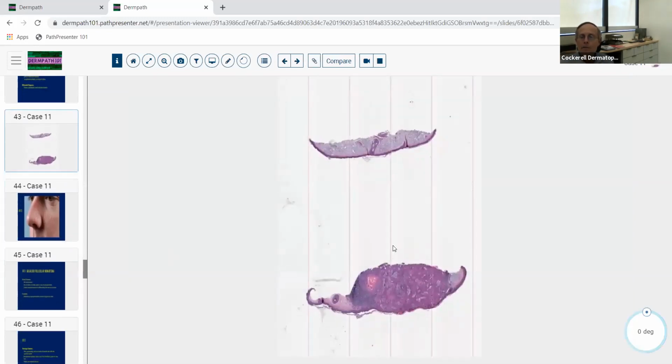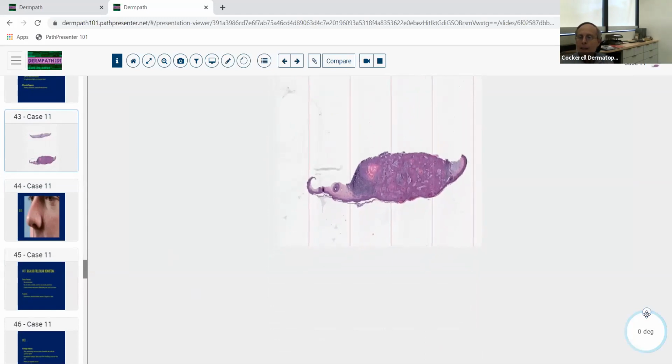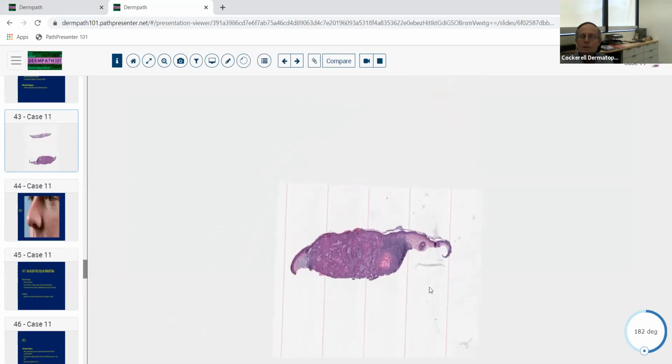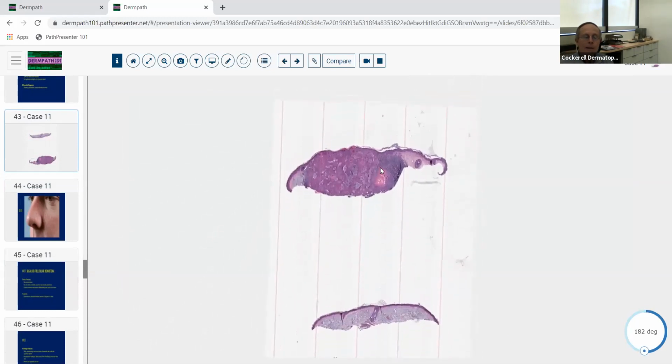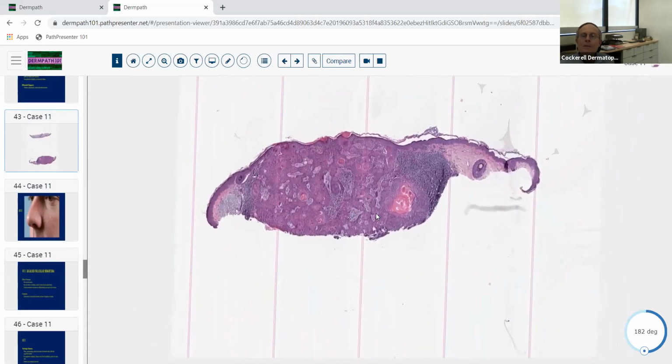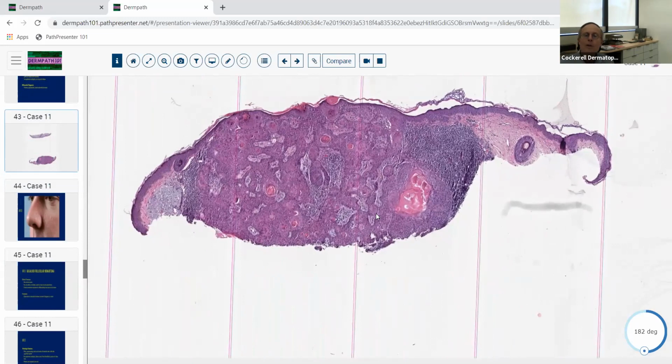Okay, let's take a look at this one. So we've got a lot of neoplasms today. Maybe next time we'll do more inflammatory things for you guys, but we're hitting some neoplasms here. So we've got a shave biopsy, and we've got something again. Would you call this symmetrical or asymmetrical? Very symmetrical, very small, and very well circumscribed. Kind of draw a line around this whole thing. It's pretty much about the same size as that sebaceous adenoma we had a few minutes ago.